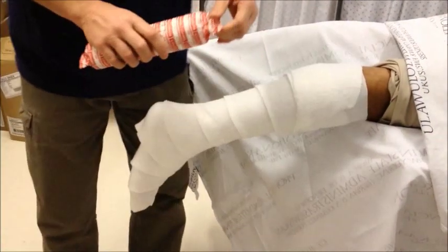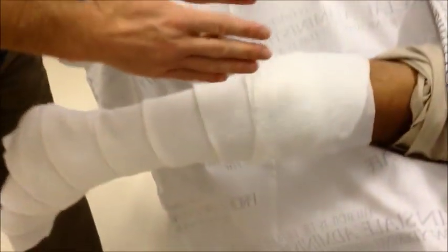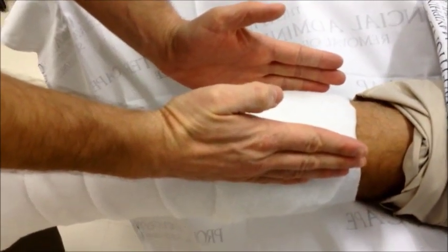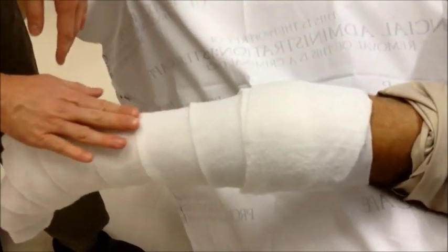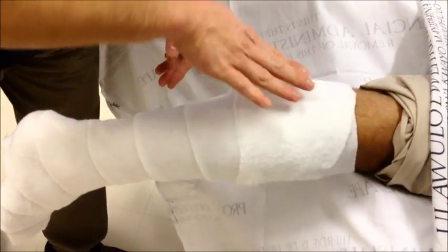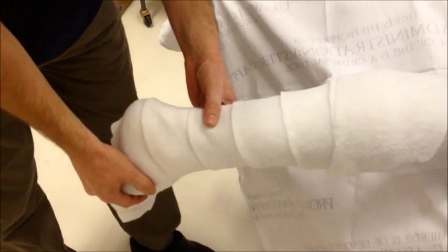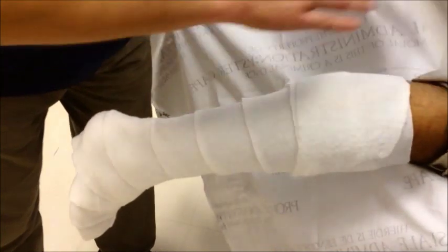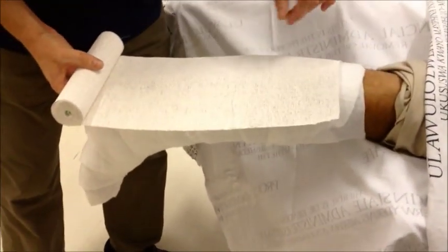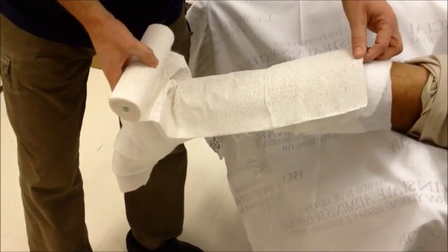The next thing we need to do is to select the correct width of the plaster. It's a common misconception to think that if you're placing a back slab, it should be the width of the limb you're applying it to. But if you have a slab just lying on the back of the limb, you can only provide control in one dimension. Most of these injuries have three dimensional instabilities and these joints are mobile in three dimensions, so it's important to provide three dimensional control. Therefore, the correct width is the widest possible slab that will wrap around the leg but not actually touch in the front. Check this every time you do it — you'll be surprised, often it's a little bit wider than you would have imagined.